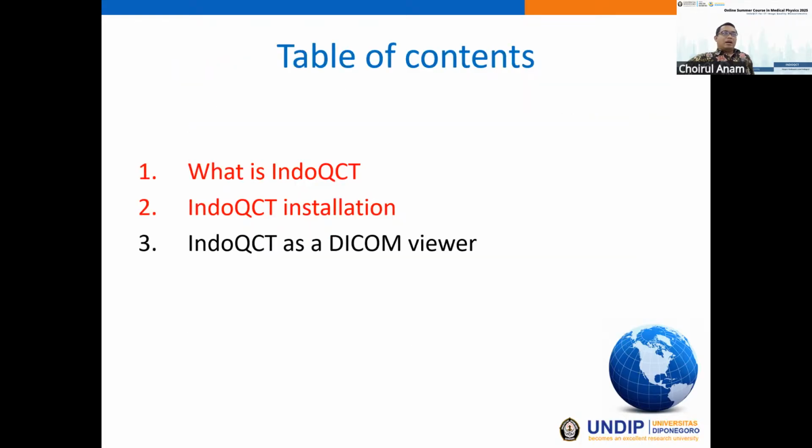And as I already mentioned, the IndoQCT can also make the computational phantom. This is very important for education. So we can develop the phantom, we can add the noise, we can add the spatial resolution using the model, and after that we can see the appearance of the image, we can see the texture of the image. This is very simple to be done and without scanning in the hospital. So it is very useful for educational purposes.